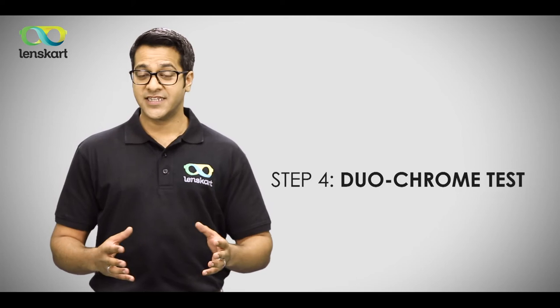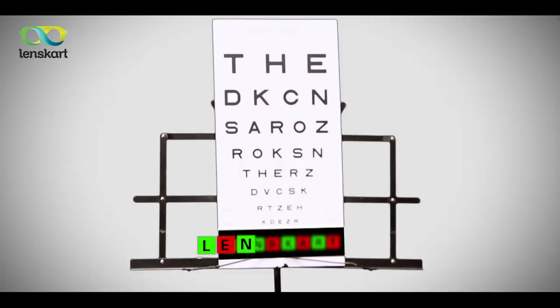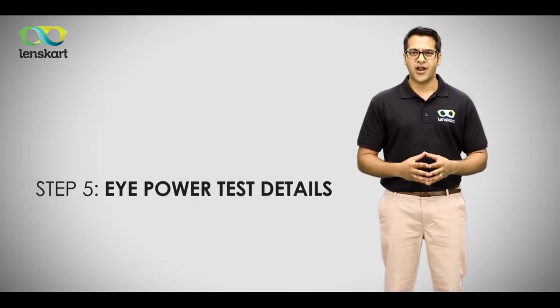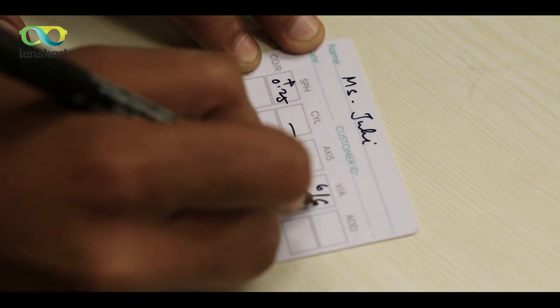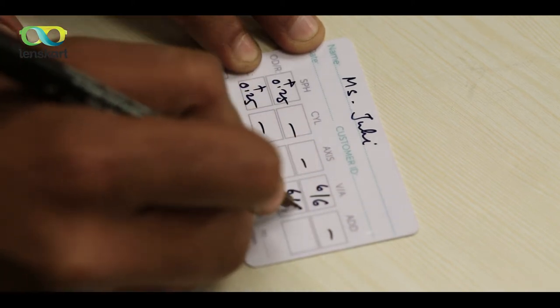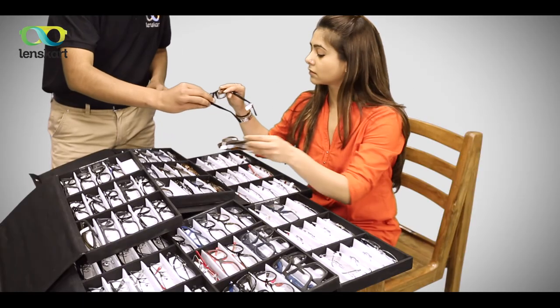Step four: the last and final test is the duochrome test, which is an extra validation for your eye power. At this point, your eye test is successfully done, and our team member will share a prescription card with your eye power details.